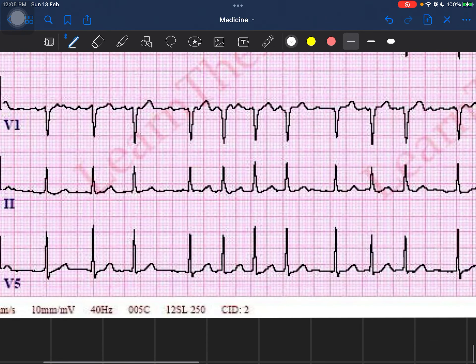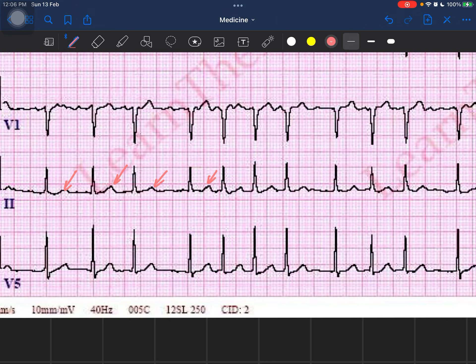Now let's look at the P wave. A common rookie mistake is to call the first visible positive deflection a P wave. We assume every ECG must have a P wave, QRS complex, and T wave — but that is not always true. The P wave is defined as the first positive deflection in an ECG. The first negative deflection following the P wave is the Q wave, the positive deflection following the Q wave is the R wave, the negative deflection following the R wave is the S wave, and the first positive deflection following the S wave is the T wave.